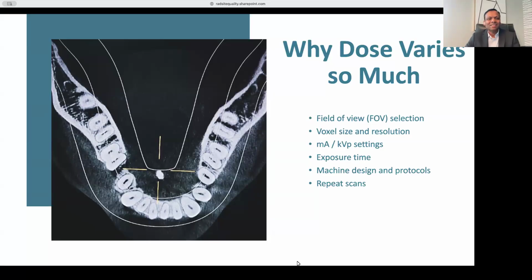Okay, let me start. So obviously for medical imaging, I will definitely ask for a shield, versus if it is an intraoral radiograph, I would probably just shy away from that. But for cone beam CT, I think we should still recommend getting one. Yeah, I would. The times that I've had it, it's mandatory in the state that I live in to put a lead apron on the patient. However, when I've had the cone beam CT or intraoral, panoramic, sorry, there was no lead shield required because it's just really centered around the jaw.